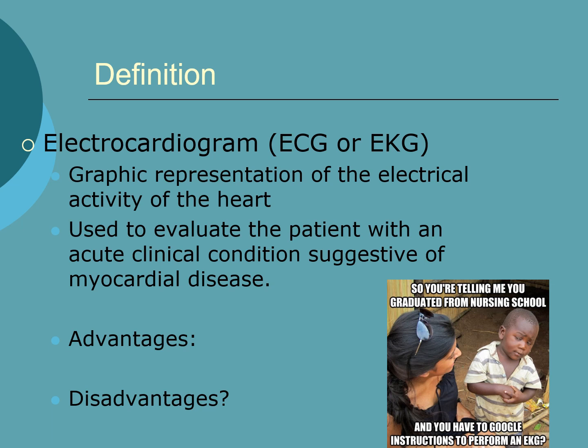So what we're doing is we're trying to look at an acute condition that would suggest there's heart disease going on. Sometimes we'll do an EKG and there's no condition showing up on the EKG, but it's showing up in their lab. Someone comes into the hospital with chest pain, we're still going to do an EKG or an ECG, and it may be a myocardial infarction.